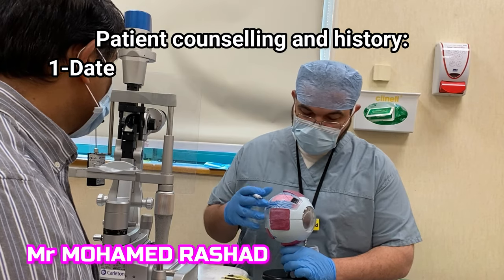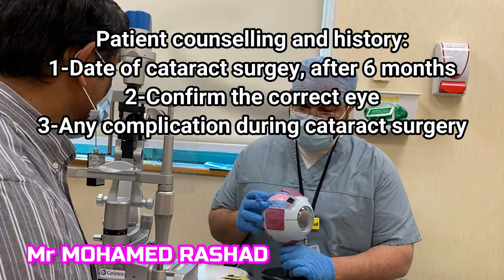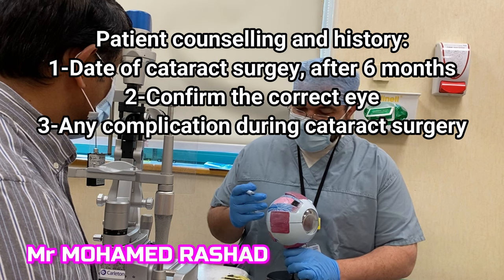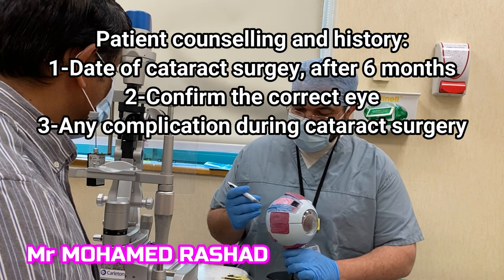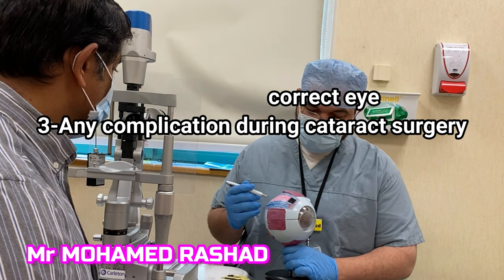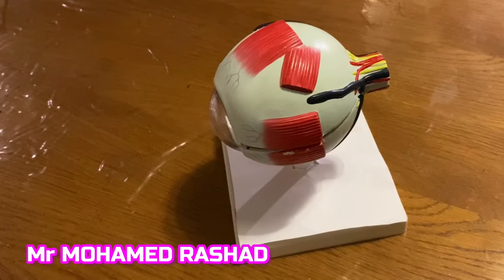On the day of the laser, you have to counsel the patient and take consent and confirm the eye. It is better to be done after six months from the cataract surgery in uncomplicated cases.